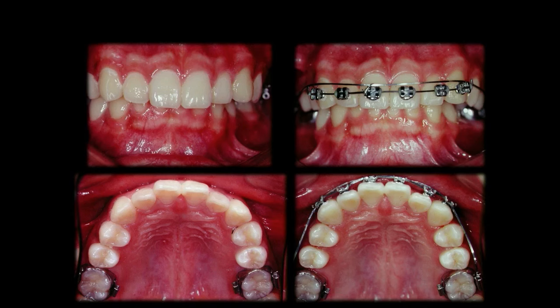What is required in this patient is correction of deep overbite and class 2 molar relationship. The intrusion of spring produced not only intrusion of the incisors, but extrusion of posterior teeth and tip back of upper molar as a side effect, and it would be beneficial in this patient.